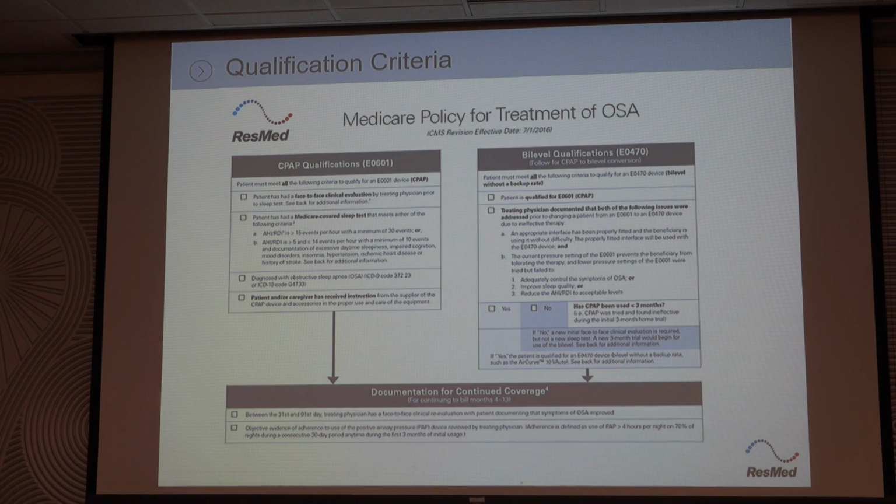The giant part was right. The silent, I'm thinking it was manufactured at a deaf college or something, because it was about like a weed whacker you would hear, and patients slept through it. But the guidelines at that time, Medicare said you had to have 30 apneas over, I think, a 6-hour period or something like that. When a lot of these patients don't have apneas, they have hypopneas. And so it was really hard to get those patients covered, and sometimes. And I think we had Blue Cross that actually said you had to desat also.